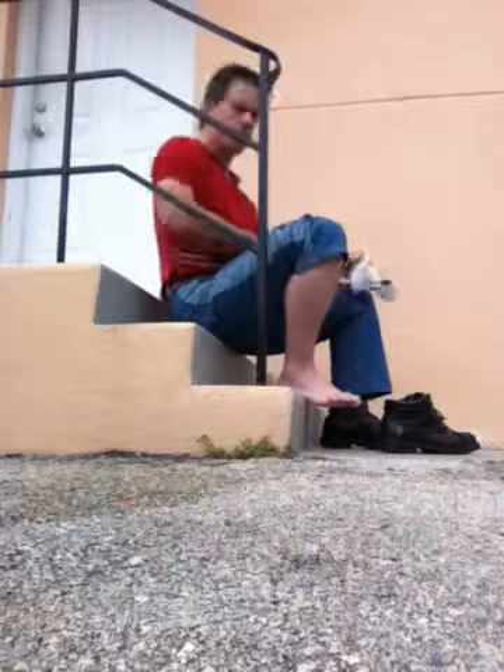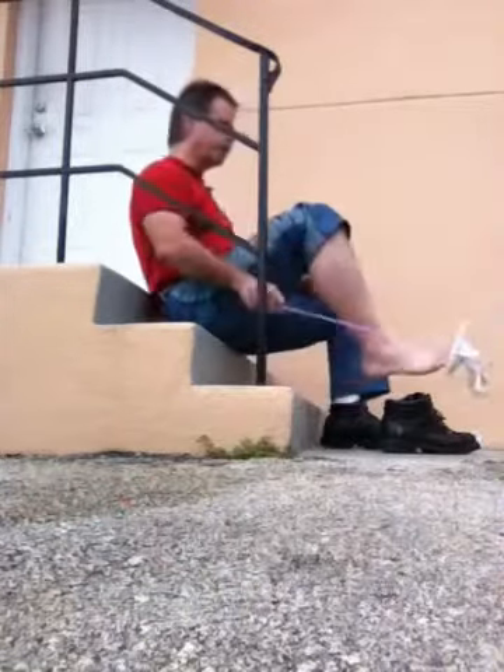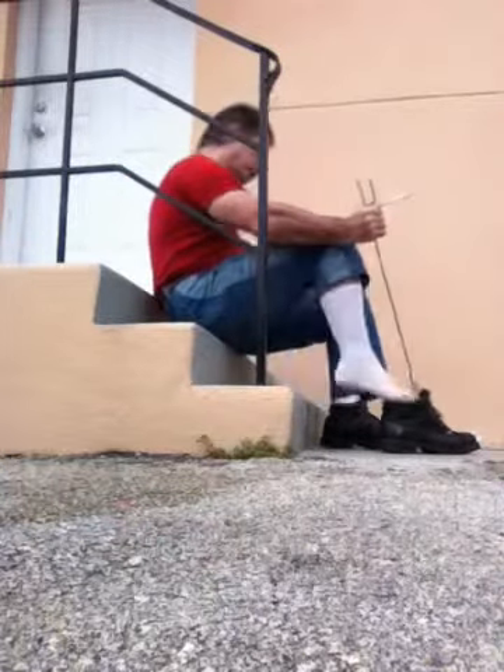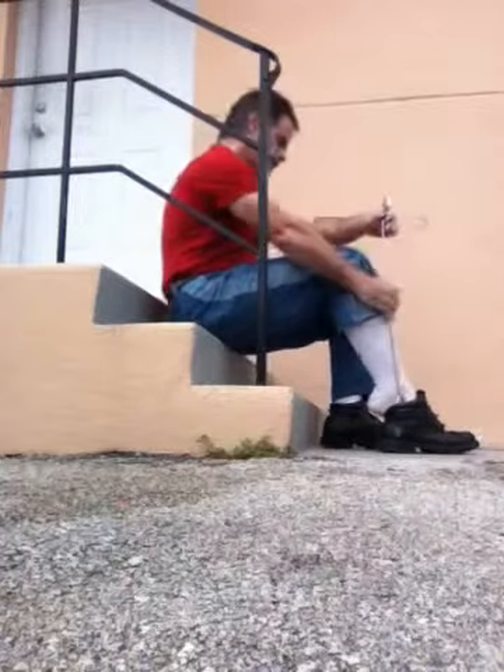This is great because then you don't need to bend over too much. I don't have a problem with my back, but if I do, this would be great. Or if you have a problem putting on your socks and shoes.